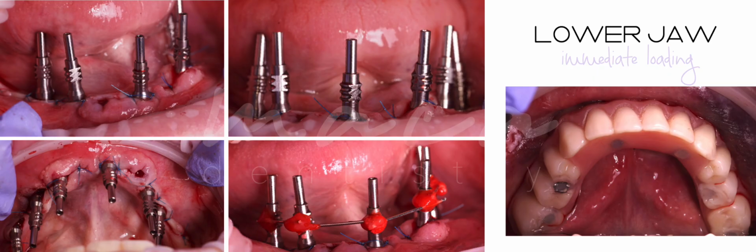So after placement of the OMNI abutments, and to be able to deliver a provisional fixed prosthesis on the same day of the surgery, I did a full arch conventional impression over the OMNI abutments of all implants. I also placed 3 temporary titanium abutments over the OMNIs and attached the interim prosthesis to the temporary abutments using tooth color acrylic resin. Finally, a full arch provisional screwed restoration was delivered.